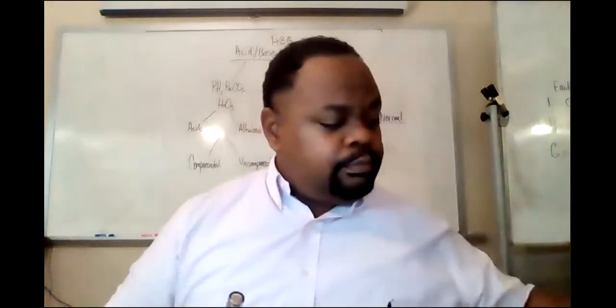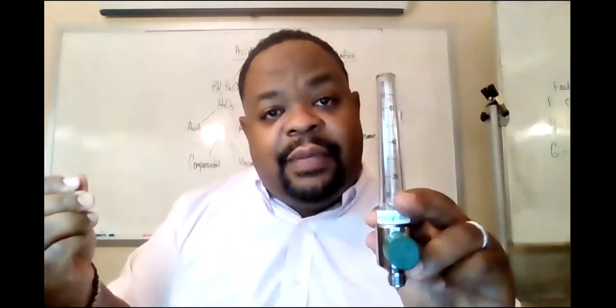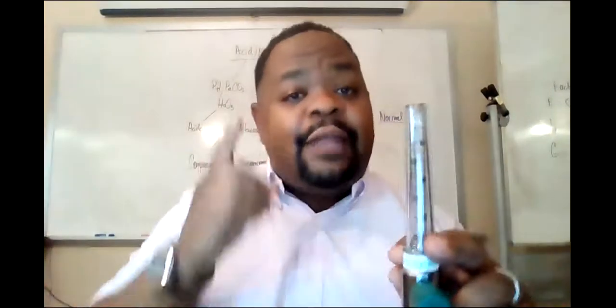Now in an uncompensated Thorpe tube, if I got him on 6 liters, and I turn the oxygen on, right? And it's on 6 liters. And he takes it and he crumples it up and kinks it. He's not getting any oxygen, but it'll still say 6 right here. And so that'll fool you. Like, well, he's saying he's on 6 liters. Why is he turning blue? He's turning blue because he's not getting it, because the oxygen tubing is kinked up. But because you don't have a compensated Thorpe tube, you wouldn't know that.